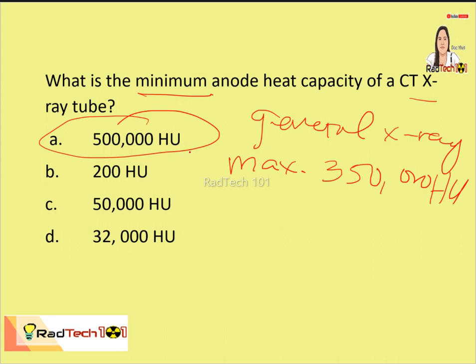Therefore, this means that the CT scan can accommodate much higher heat capacity, and also, meaning we can perform several examinations one after the other, because its heat capacity is higher.